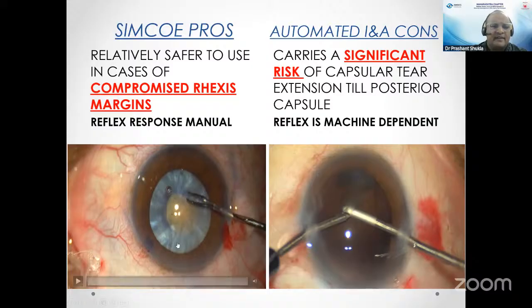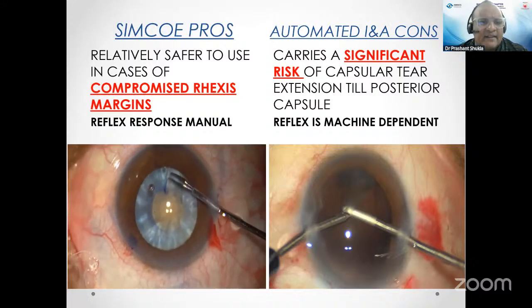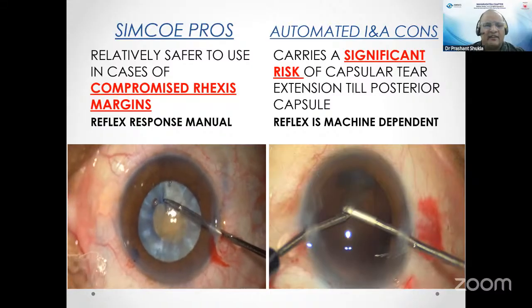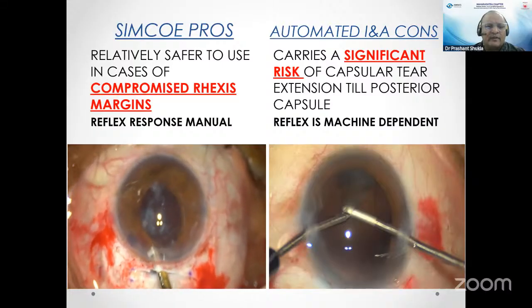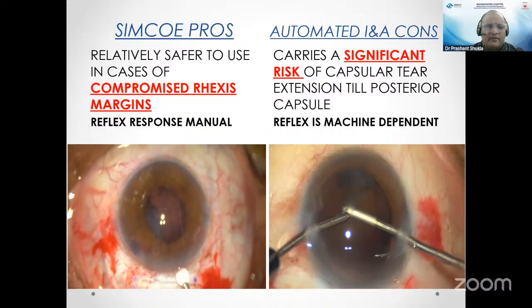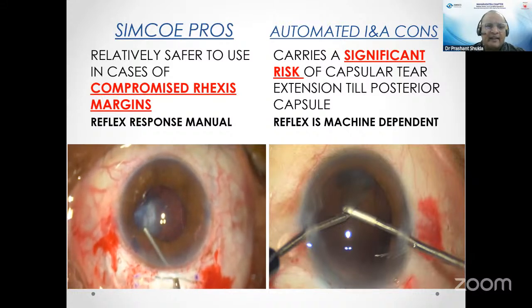After decompressing the bag, after doing a small rhexis, the moment I initiated the larger rhexis, the rhexis went to the periphery and there was a rhexis run out. So I thought it would be a good idea, considering the size of the nucleus and the poorly dilating pupil, I converted it. With the water jet, superficial cortex is now removed and the epinucleus is just irrigated out. And now the pupil has come down. So I thought, let's do a viscomydriasis to just isolate the cortical chunk, just like that.